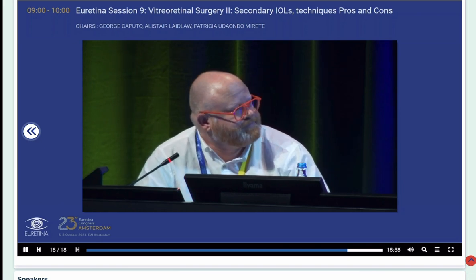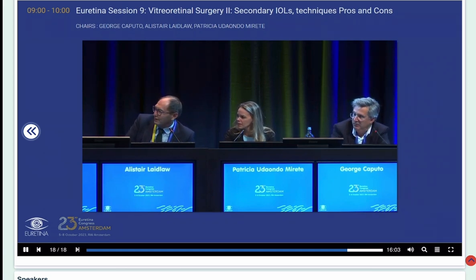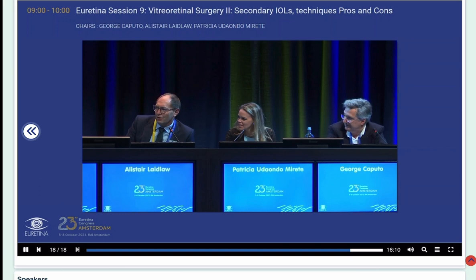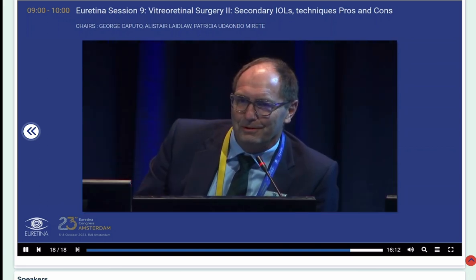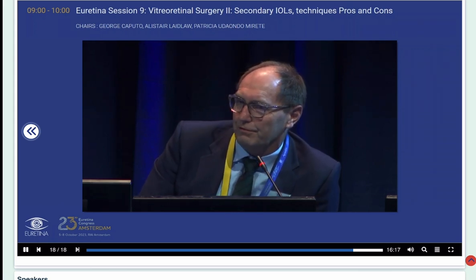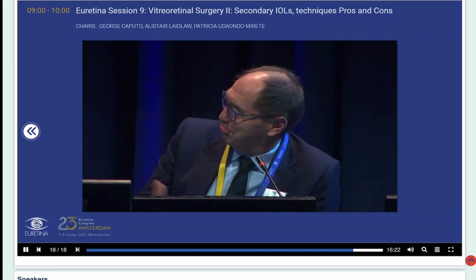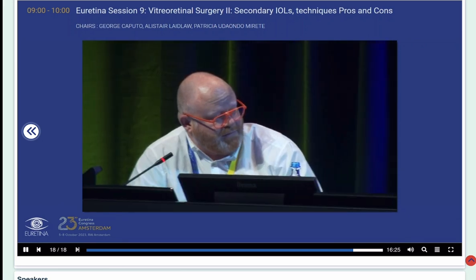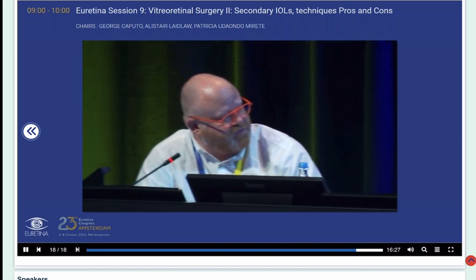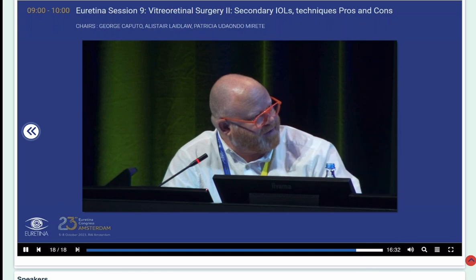And then I think a last one, somebody's asked, how much vitrectomy should we be doing with these lenses? Because the vitreous can end up mysteriously, it wasn't there at the end of the op, but then there's a little peaked pupil and it doesn't look quite as neat as you thought it was. So should all of these have a full PPV, or should it be just a little anterior clear up? Anyone? Igor? If I do them with a dropped IOL or a dropped nucleus, I do a full vitrectomy, usually also with a prophylactic laser.